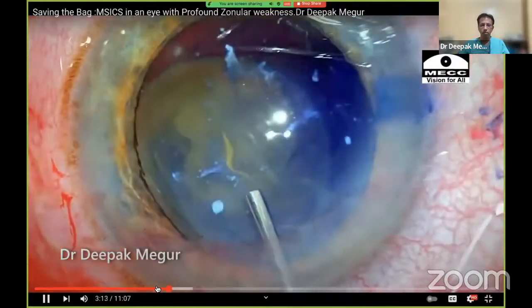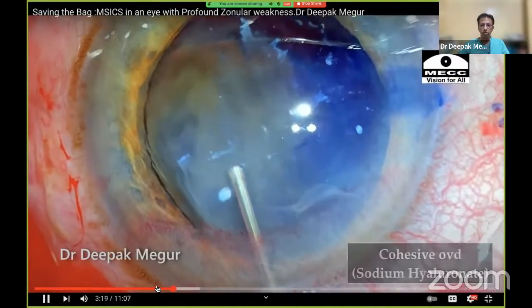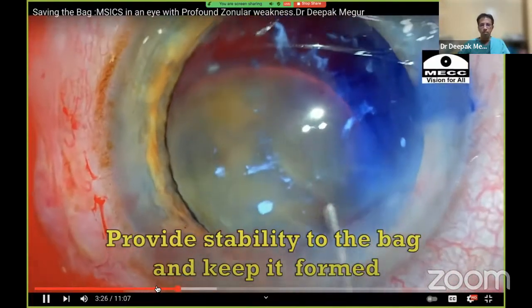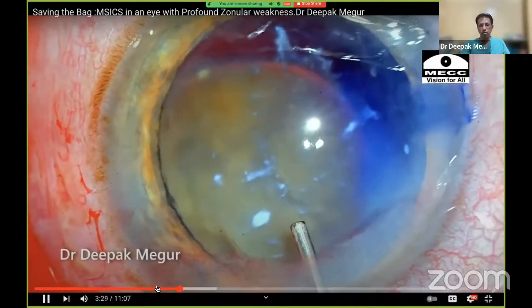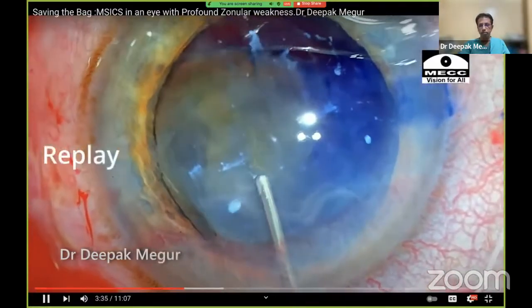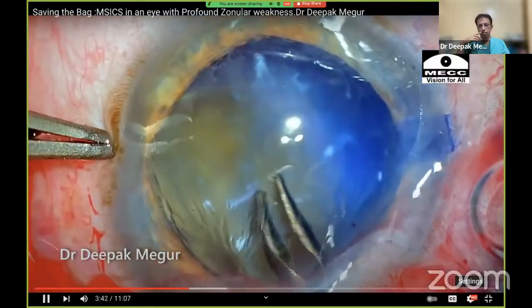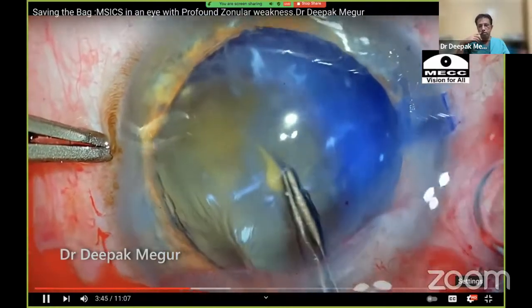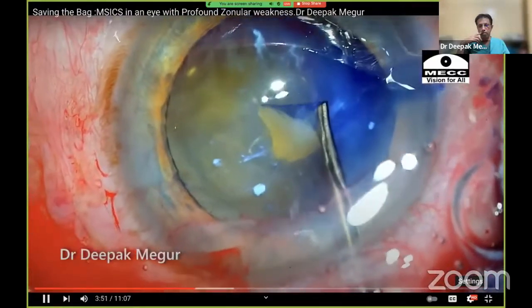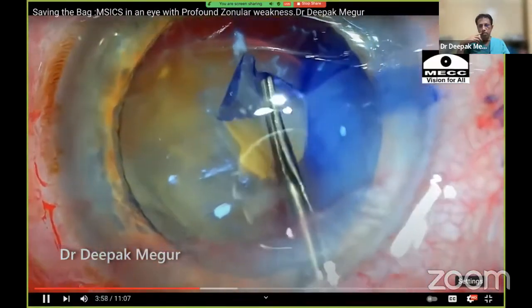The first thing I'm going to do is inject cohesive OVD — sodium hyaluronate — into the bag and also into the anterior chamber. The idea of inflating it into the bag is that it provides stability to the bag, keeps it formed, and may provide some traction force to ease the capsulorrhexis. Filling the bag with high molecular weight viscoelastic should help. In eyes with loose zonules, capsulorrhexis forceps is the best tool. I've gone in with my capsulorrhexis forceps, holding the flap and trying to tear it, and the enormous zonular laxity is evident with multiple folds.